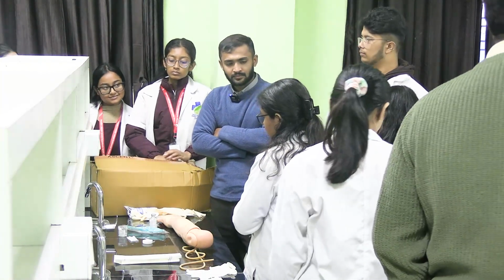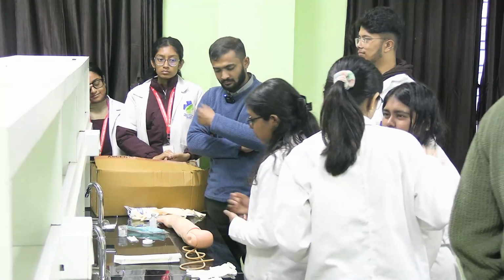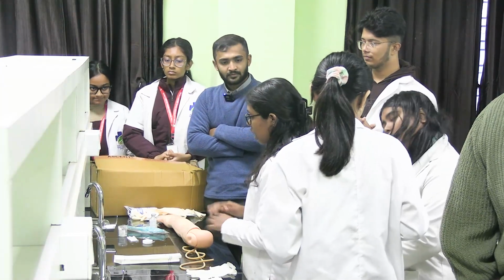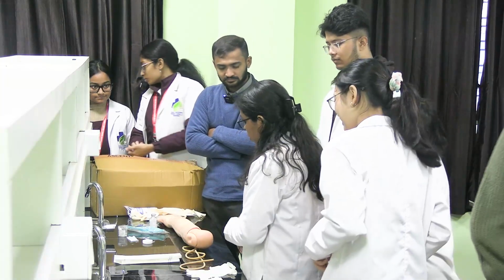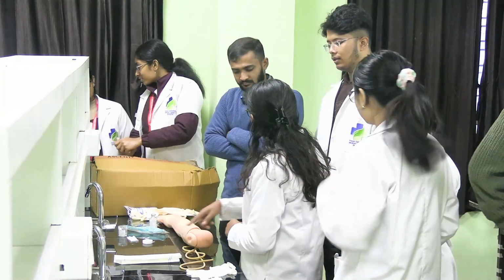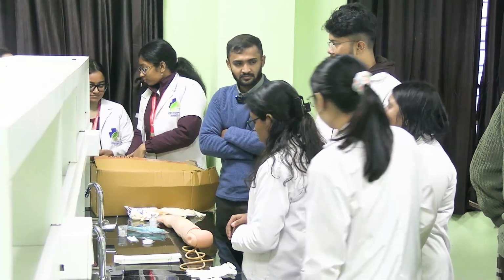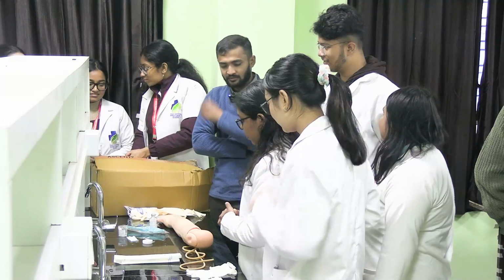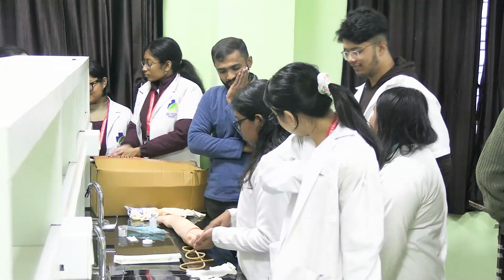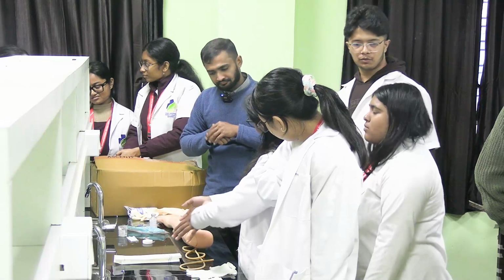Then I'll wash my hands and proceed with the gloves. Before touching the gloves, I'll see whether they are sterile and sealed or not. Then to get the size: how do we know the size? You have to wear it, and then you can identify it. I'll ask the nurse to open it.